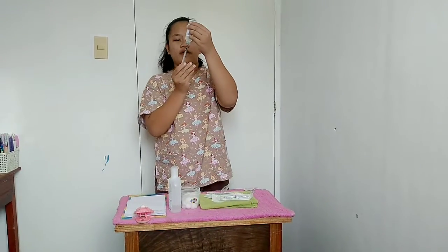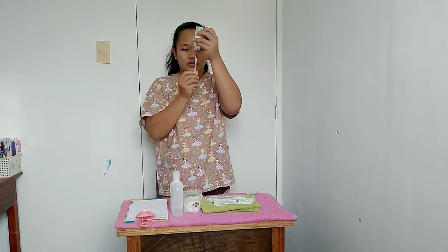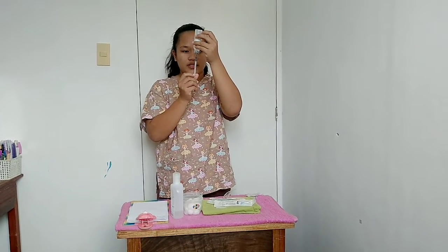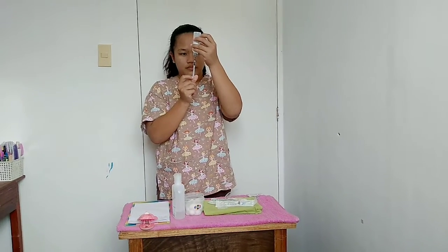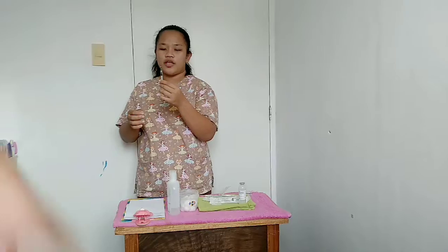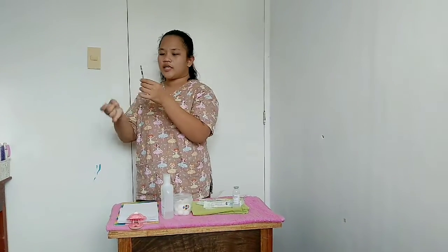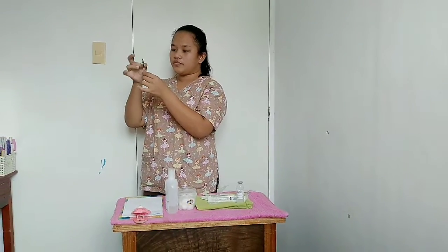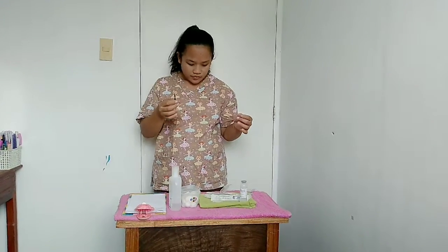Then invert the vial and draw the medication that is exactly needed. If there is air or a bubble in the syringe, gently tap it.